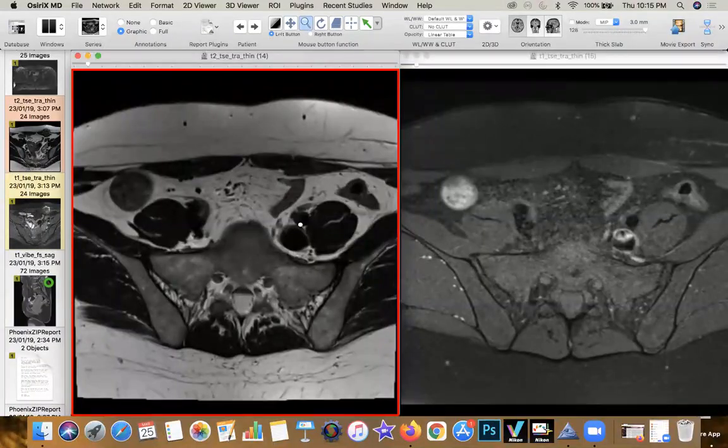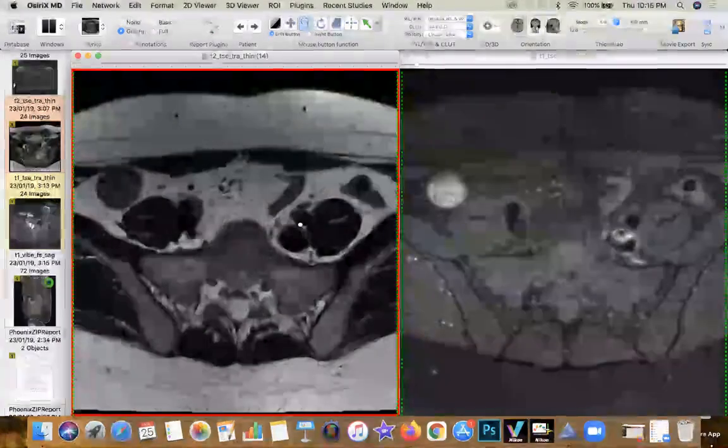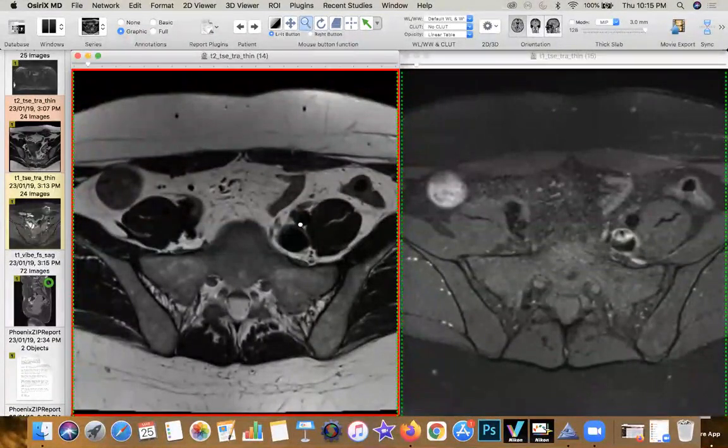So this is very important, that whenever you're having surgical or post-surgical states and patients presenting with non-specific abdominal pain, which is not related to the hollow viscus, it's pertinent for you to use the entire gamut of imaging to make sure there's no evidence of endometriosis. And especially if they ask you that this patient has had a uterine surgery, it's better for you to not do CT, but migrate to MR.